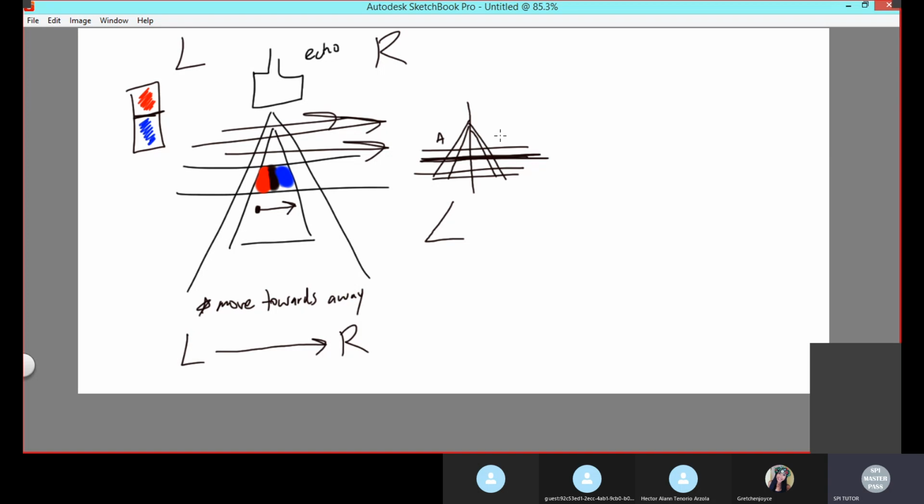So if it's not stated otherwise, that's what you should assume. And I'm going to get to the linear soon, so I'll explain that as well. I'll go into detail. For this sector though, this one's a little bit tougher because if you're echo, you know that your right side is actually your left side. So I would think it's all about where your indicator is.